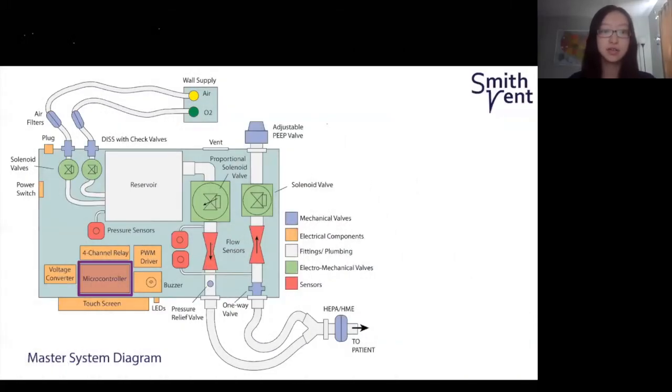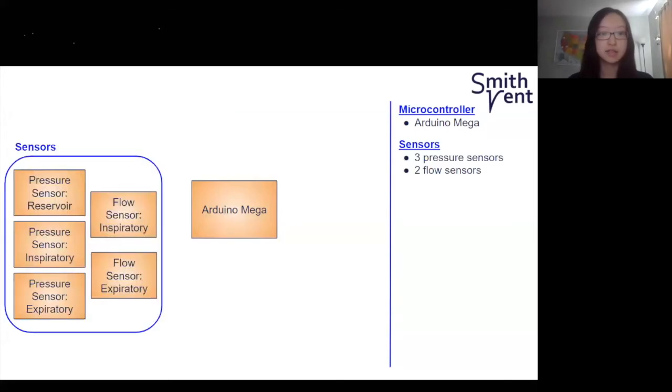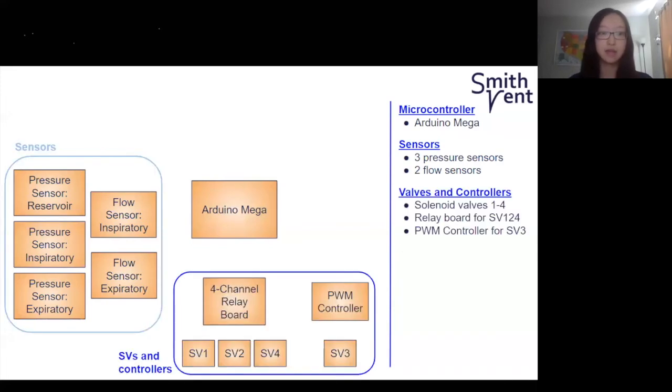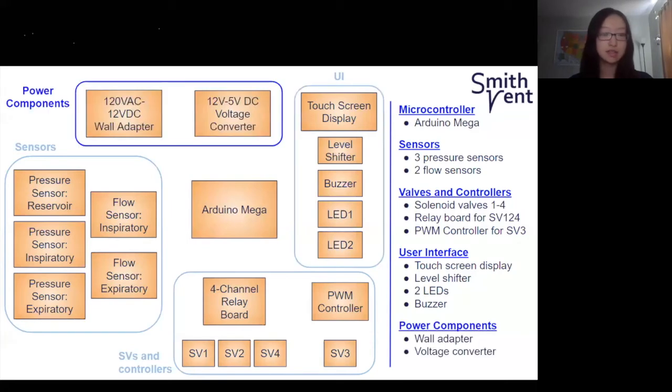So next, I'll introduce the electrical system. The brain of the system is a microcontroller board, Arduino Mega. Then there are 5 sensors in the system, 3 pressure sensors and 2 flow sensors. We also have 4 solenoid valves and their controllers, and a user interface, including a touchscreen display with a level shifter, 1 buzzer, and 2 LEDs. And last but not least, the power management components. All the electrical components are off the shelf and were selected based on system requirements. Then I'm going to talk about how signal flows through all these components.